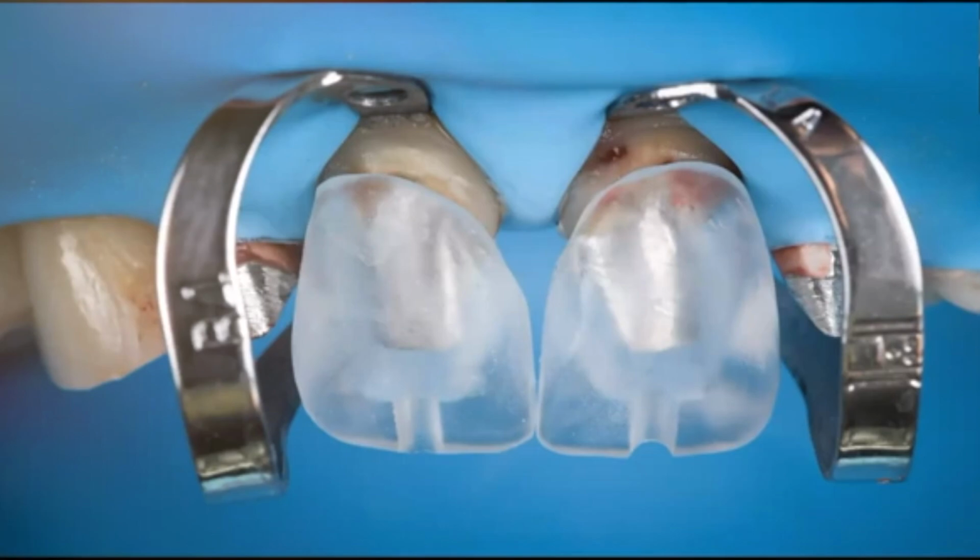But in the inside of this, you can design your ideal abutment, okay? Which means it's going to be like a coping, but inside is the ideal abutment that guarantees uniform thickness for the final ceramics. And it has also like a cylinder for the material to flow out.